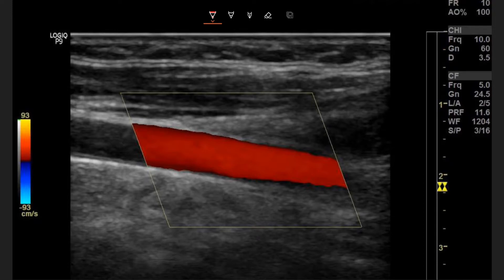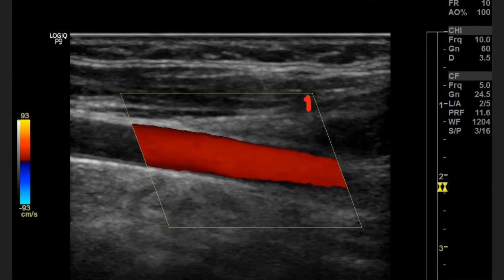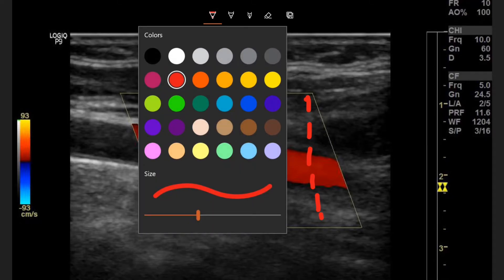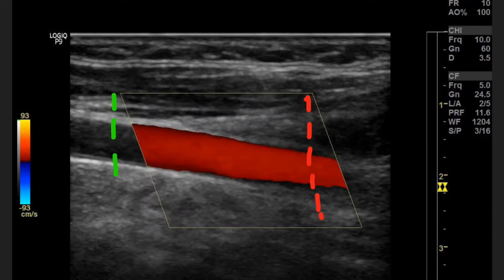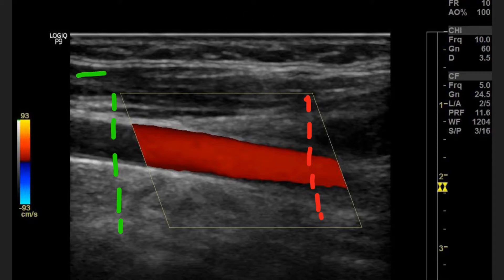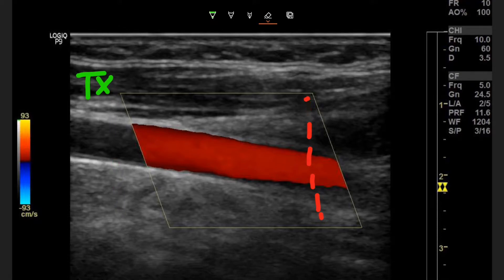We're going to be doing left to right and right to left. For the home line method, I'm going to start by drawing an imaginary line from the top of the color box all the way down to the bottom. This line is inside of the color box, so this is not our transducer location. On the left side, I'm going to draw another imaginary line down — this line is outside of the color box, so this is our transducer location. You want to make sure the imaginary line you draw is outside of the color box.